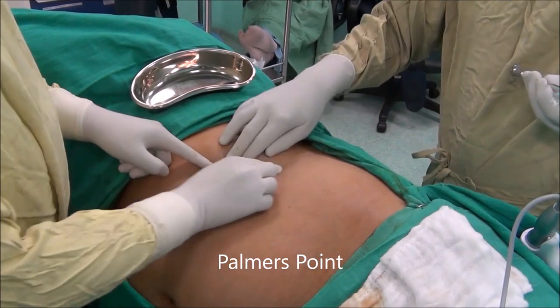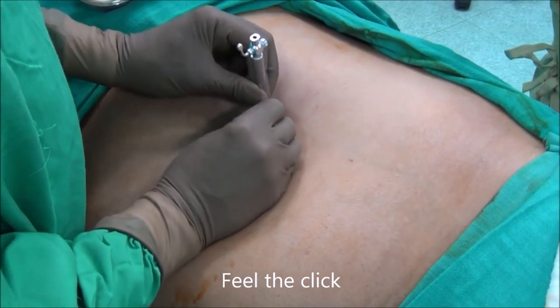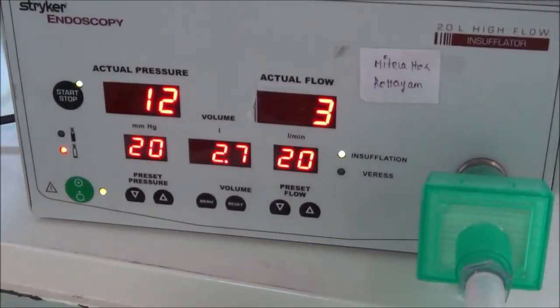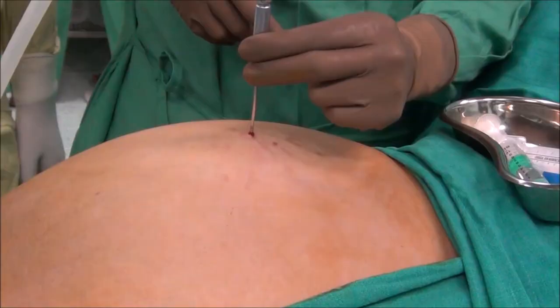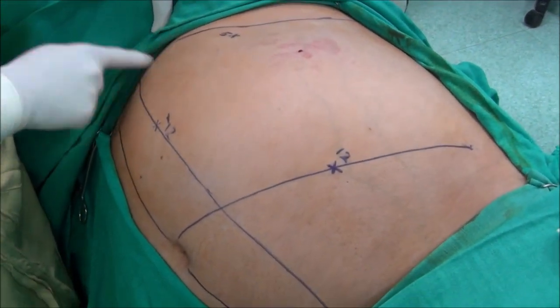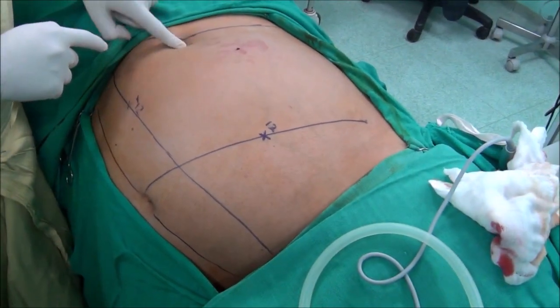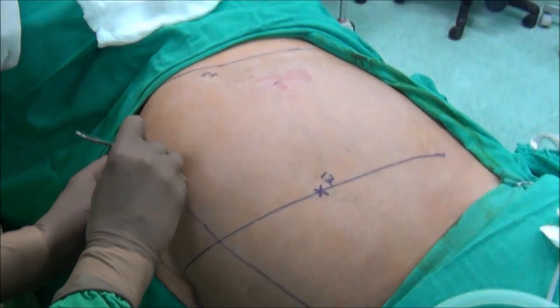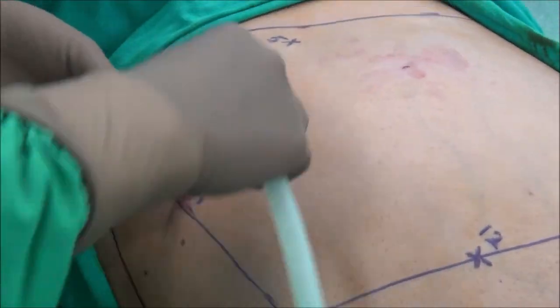This is a small video presentation for port placement for left radical nephrectomy. We use a Veress needle at Palmer's point. Feel for two clicks, followed by free flow of normal saline through the Veress needle into the intra-abdominal space. Initially we maintain pressure at 20 mmHg; once all ports are placed, it is reduced to 15 mmHg. Check for a gradual rise in abdominal pressure. Once the Veress needle is taken out, we do the surface marking — this is the lateral border of the rectus muscle and this is the subcostal line. The primary port is introduced between the xiphisternumand the umbilicus on the lateral border of the rectus muscle. The secondary port is placed midway between the anterior superior iliac spine and the umbilicus. You can see the diamond-shaped arrangement of the primary port, two lateral ports, and the target.